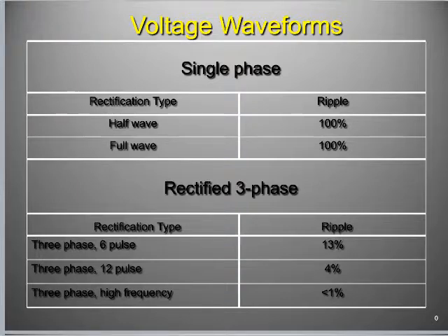He tells us that on page 123. If the magnet spins 60 revolutions per second, 120 pulses of electricity will be produced for every rotation of the magnet. And you're like, well, where did you get 120 pulses, right? Well, the pulse is any one of those waveforms. The cycle is a wave up and a wave down. In the cycle, there's two pulses. There's a pulse up and a pulse down. There's a pulse towards the dam and a pulse away from the dam. Have I lost anyone so far? That is alternating current here in the United States of America.